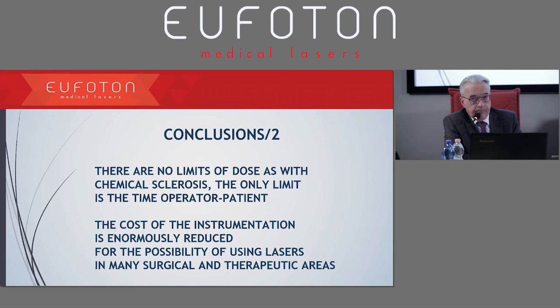I started off 15 years ago in this field, so I had to treat 5 to 6 patients a year maybe, whereas now I use that technique. I determine the completion of my treatment with sclerotherapy and with laser.